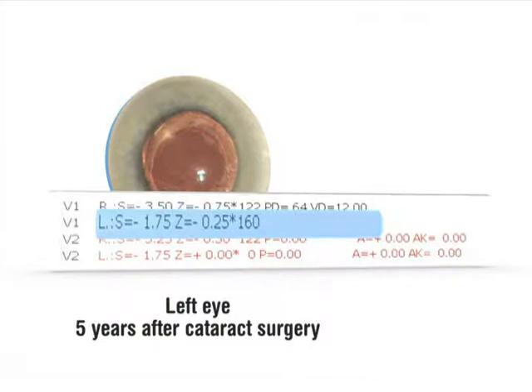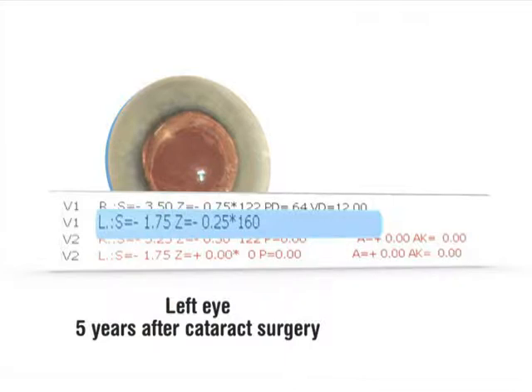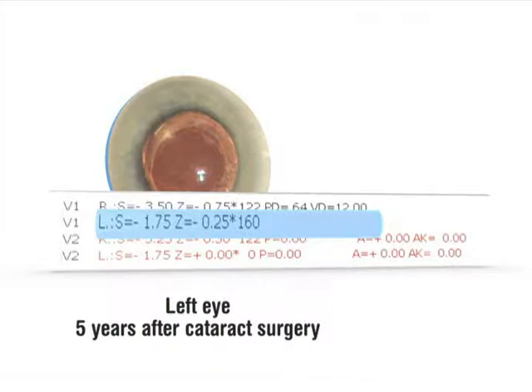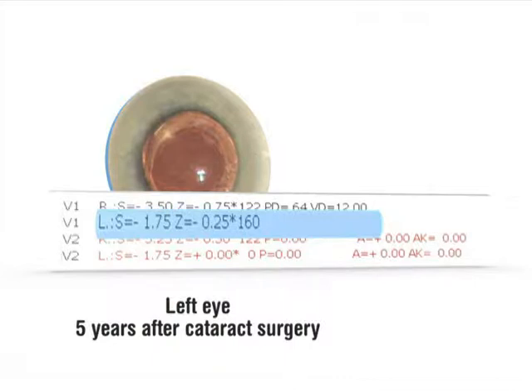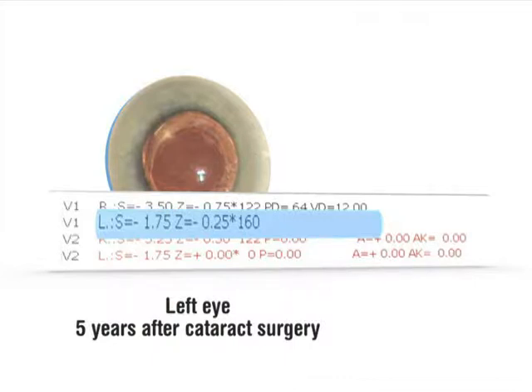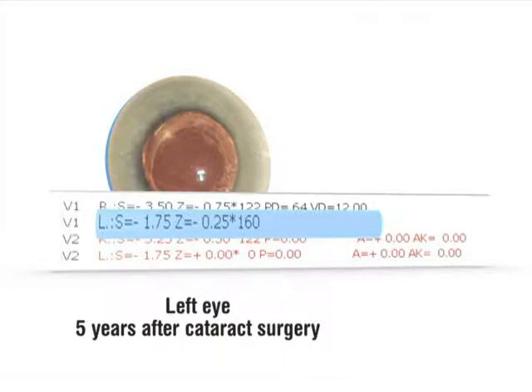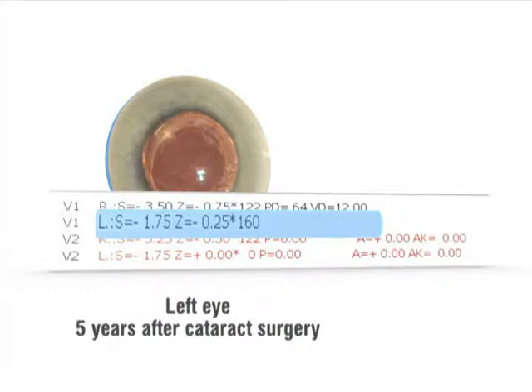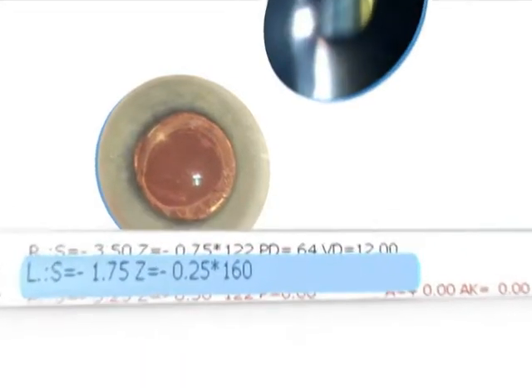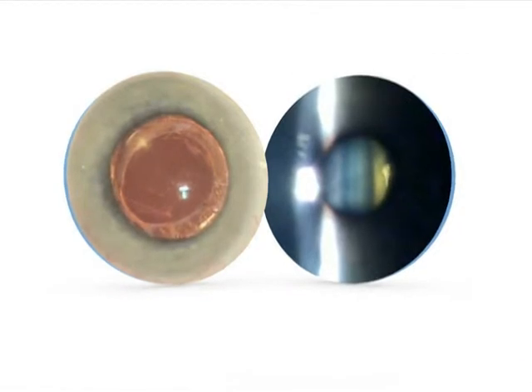Together with the pre-existing myopia in his non-operated contralateral right eye, this slight postoperative myopia in his left eye worked well. But now the right eye has developed a cataract as well.